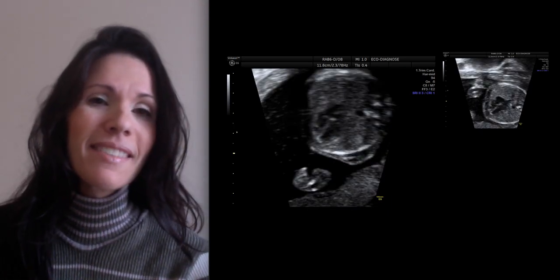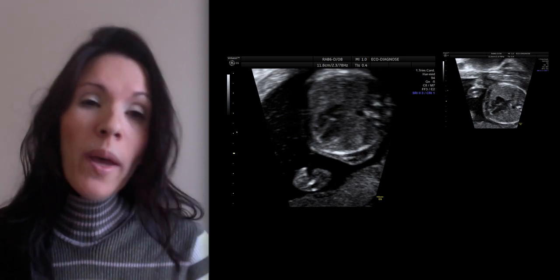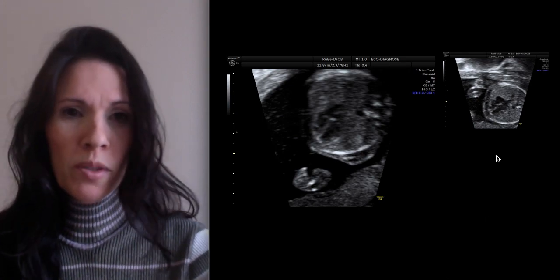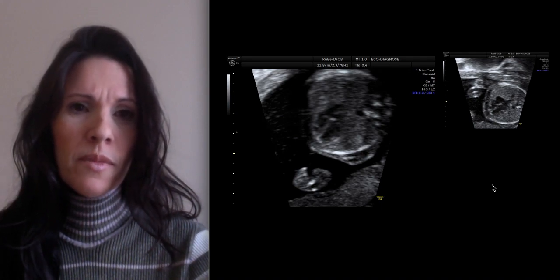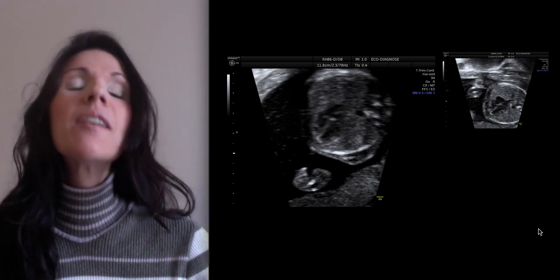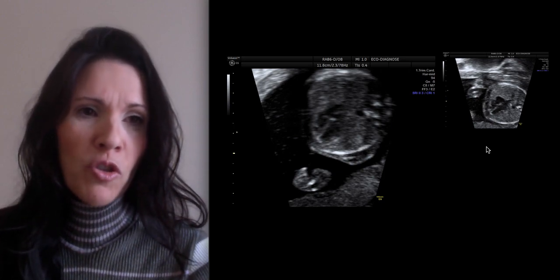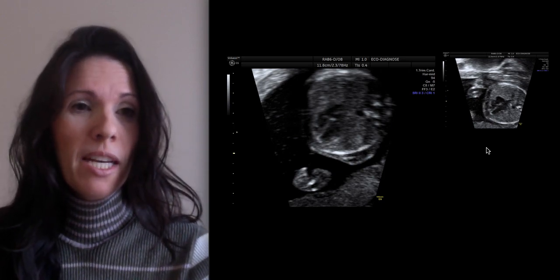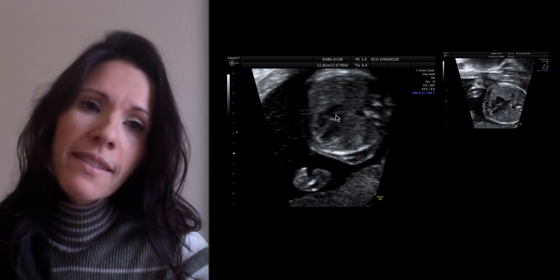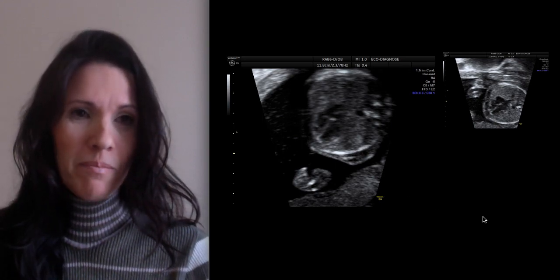And here, this image is from yesterday at 28 weeks. At 28 weeks, I got this image to be sure, okay? And no, this is from 20 weeks. But at 20 weeks, you can see even the left chambers are bigger than right chambers with that disproportion. And here you can see the coronary sinus, and here you can see the gap. This is a septum primum ASD, okay?